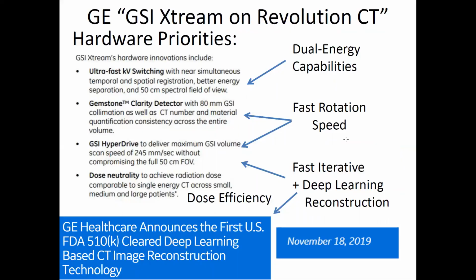So at the moment, if you're GE and you're selling CT scanners, where are you making headway, or what are you selling as the frontier at the moment? Dual energy, we'll go back to that later on, but the capability to do dual energy is done different ways with different systems. The GE system rapidly modulates the voltage on the X-ray source. Other methods are used by other vendors, and they serve a similar purpose of having some information on the X-ray energy distribution without having individual X-ray photon counting. So that's what they're referring to with the dual energy capabilities that are on the market currently.